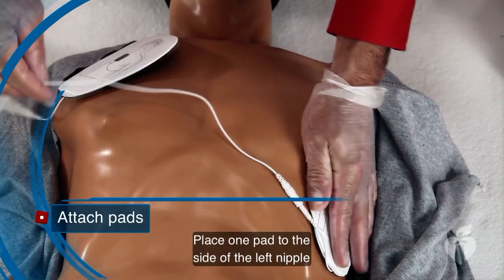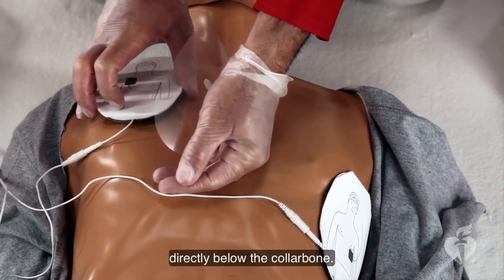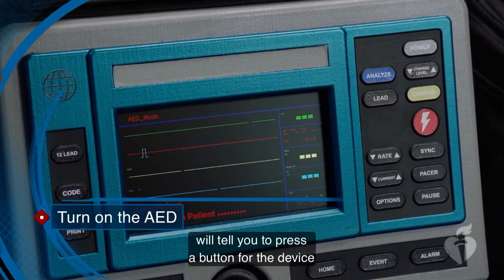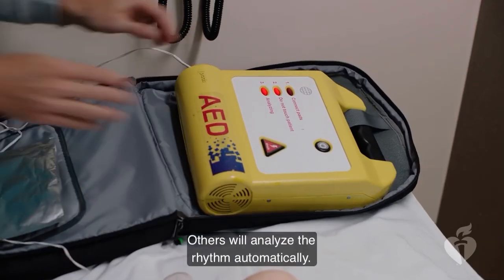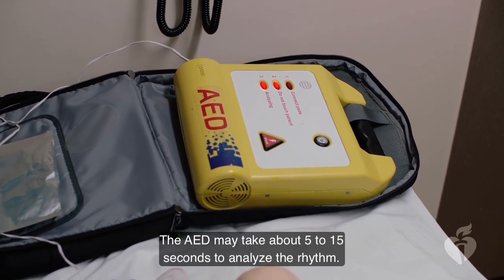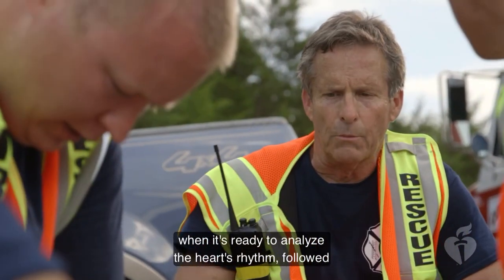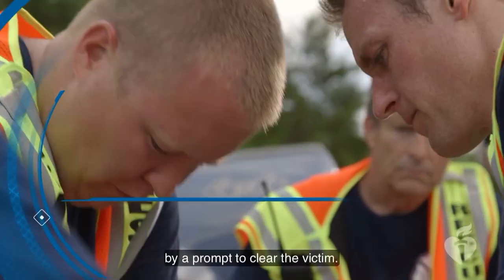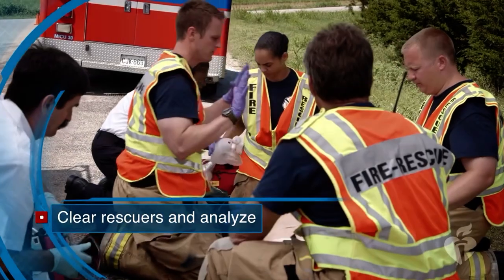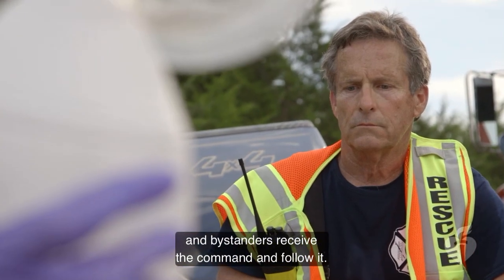Place one pad to the side of the left nipple and the other on the upper right chest, directly below the collarbone. After the AED is turned on, some units will tell you to press a button for the device to analyze the heart rhythm. Others will analyze the rhythm automatically. The AED may take about 5 to 15 seconds to analyze the rhythm. The AED will deliver an audible prompt when it's ready to analyze the heart's rhythm, followed by a prompt to clear the victim. Strongly repeat the command to clear, checking visually to be sure that all rescuers and bystanders receive the command and follow it.